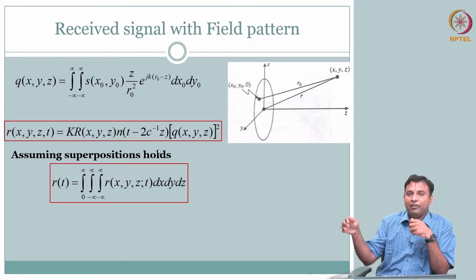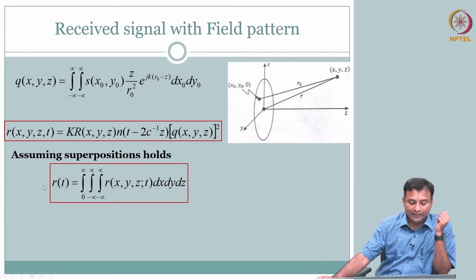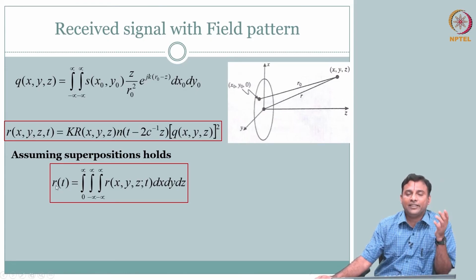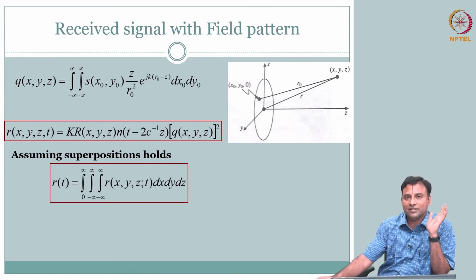When the point along the z depth is far away from the transducer, what is the pressure field? Okay. So, even though it is written as t, you should make that one extra interpretation: the R of t that you are receiving has a time axis that is going to be along the direction of propagation in some sense. Okay.